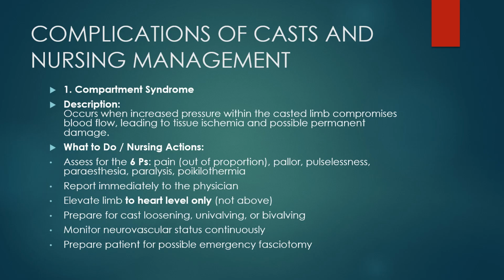And the next thing you do is monitor the neurovascular status continuously. That has to do with the circulation, sensation, and motion. Then you prepare patients for possible emergency fasciotomy, the surgical procedure aimed at relieving the increased pressure in the casted limb.